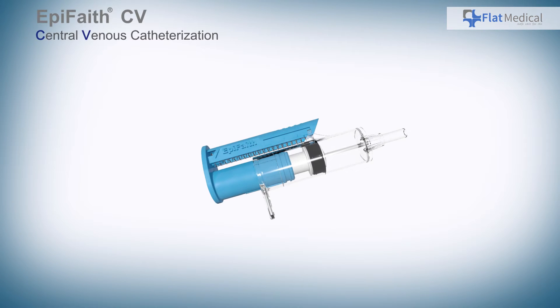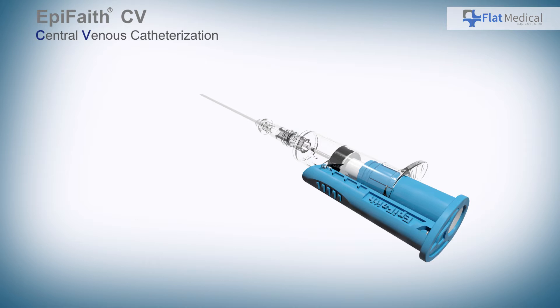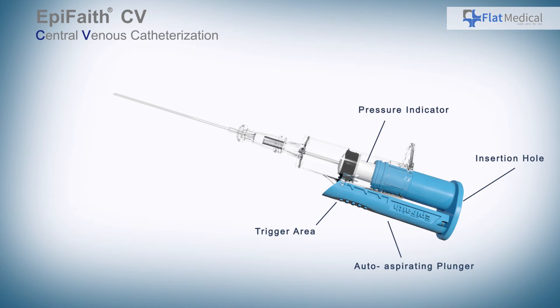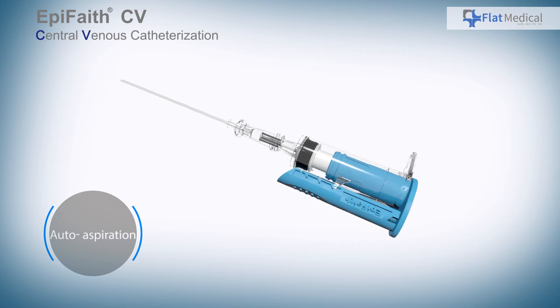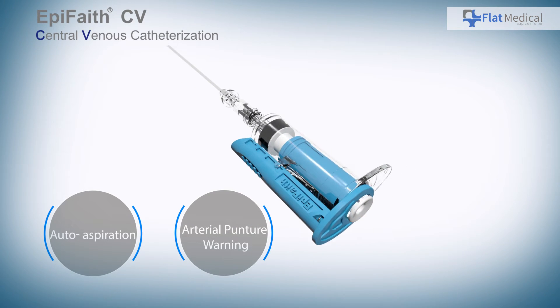EpiFaith CV is an indication syringe for central venous catheterization. In comparison to traditional syringes, EpiFaith has a better design and built-in mechanisms like the auto aspiration plunger, a guide wire insertion hole, and a pressure indicator. The auto aspiration and guide wire insertion hole can ease the operation process, and the pressure indicator provides real-time visual feedback.